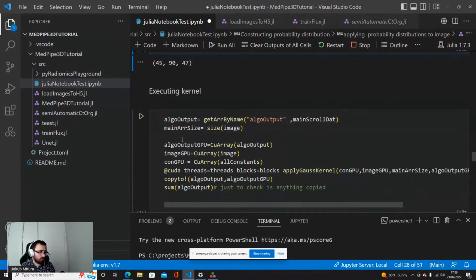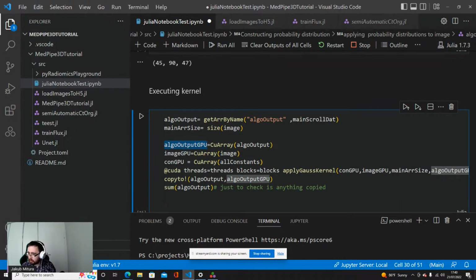Yes, and then we execute the kernel. What happens during this execution of the kernel? First of all, we need to have the data in the correct spot. So if you are from a background of dynamic languages, did you face any uncoalesced access or race condition problems? Basically, race conditions are something that happens very frequently when programming any parallel code. Yes, of course. In case of the uncoalesced access, yes.